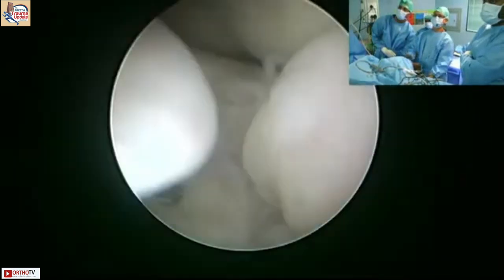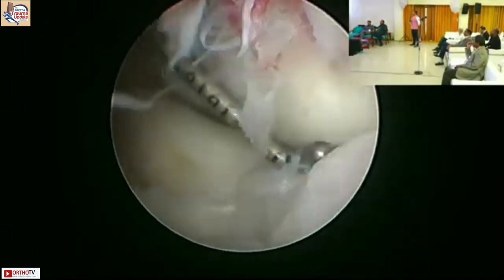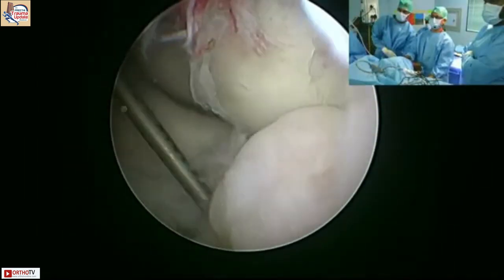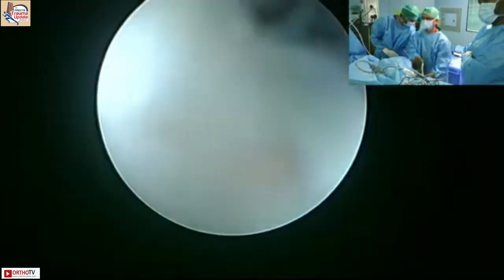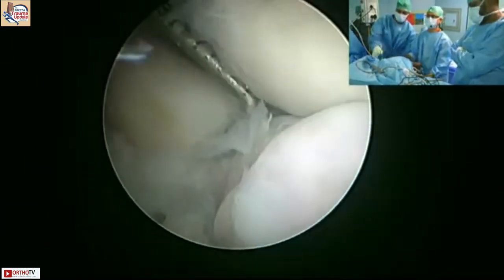So okay. What is your plan? Now you want to go posterior? Yeah, so I want to go posterior. I'm just thinking, should I burr this off? Yeah, we have burr also. Silam. Yes, sir. Yeah, burr. Let me just burr this off. So burr this off. The patient has good range of motion.